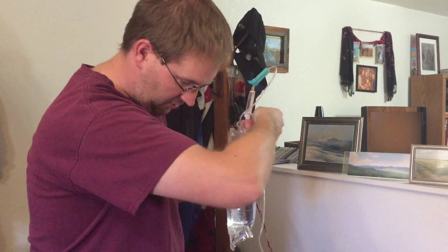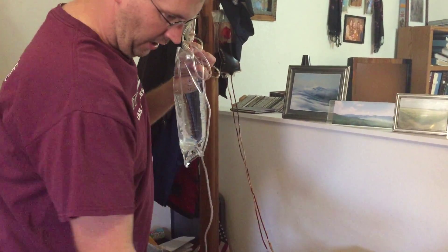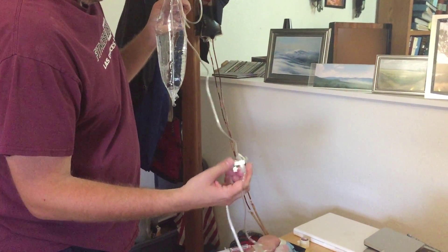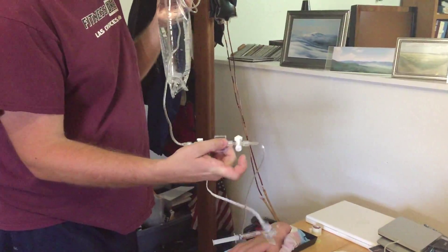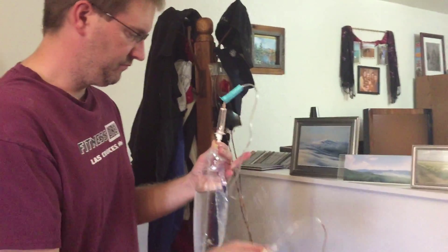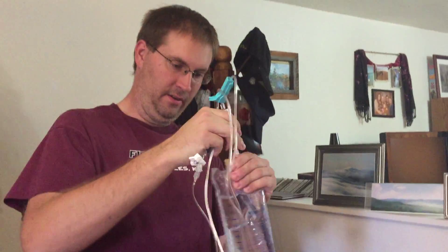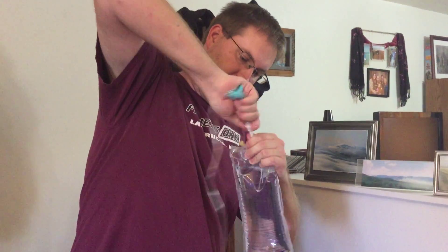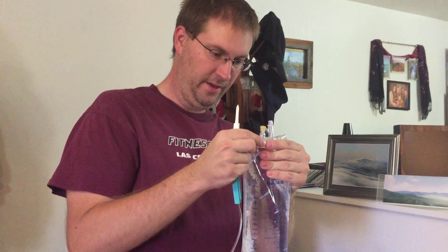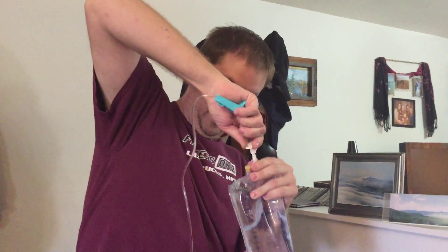I have all my tubing here. Let me check my stopcocks and make sure all the other ports are off so I get flow through here. I've got two stopcocks — that port's off and that port's off — so the tubing is now open. What I'm going to do is fill the drip chamber backwards — a kind of backfill. I'll also try to take all the air out of my IV bag as well, just flushing all the air out of it. Then I'll go ahead and spike it.